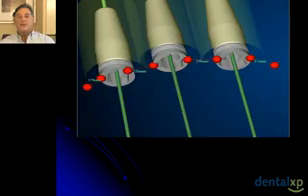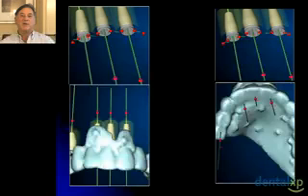To change the size of the implant, I would click on the green line, activate that implant. The drop-down box gives me a series of questions. I click Change Implant. The drop-down box allows me to pick a smaller diameter. I could click a smaller diameter, and it immediately appears. Then I could remeasure the site and say I like it or I don't like it. There's a rebound step where I can click back and get right back to where I was in case I lost my place. So here are 4 views of this planning of this particular patient.